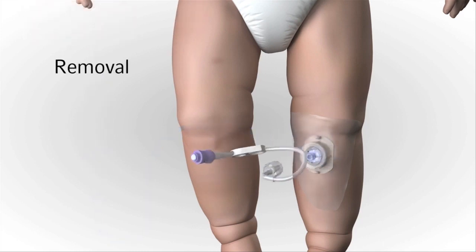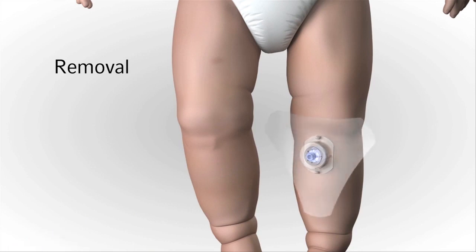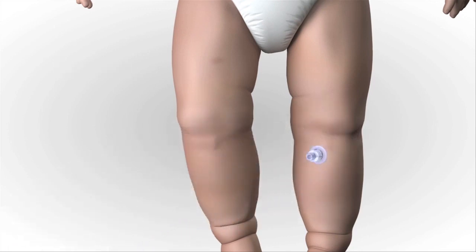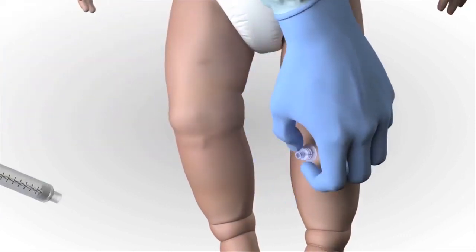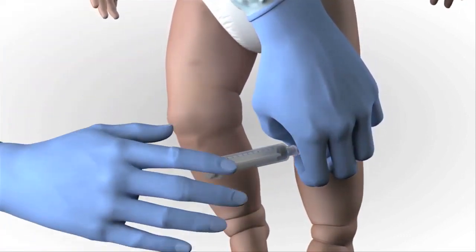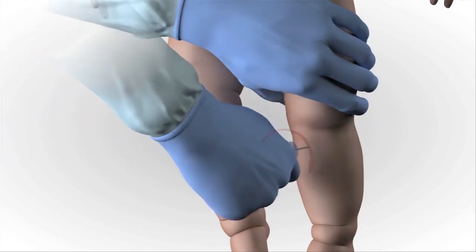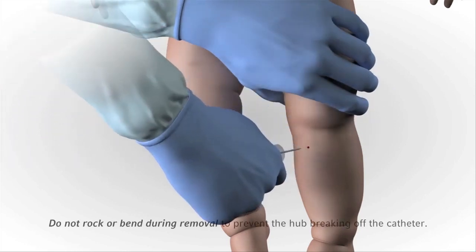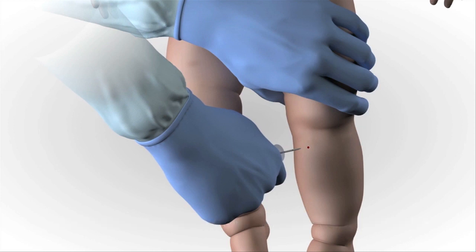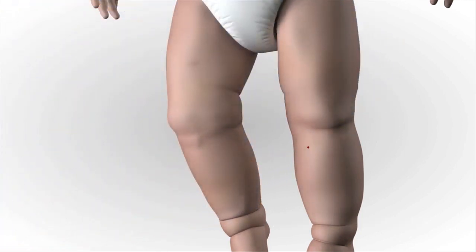Remove the extension set and dressing. Stabilize the catheter hub and attach a luer lock syringe to the hub. Maintaining axial alignment, twist clockwise and pull straight out. Do not rock the syringe. Dispose of the catheter with the syringe attached into a sharps container.